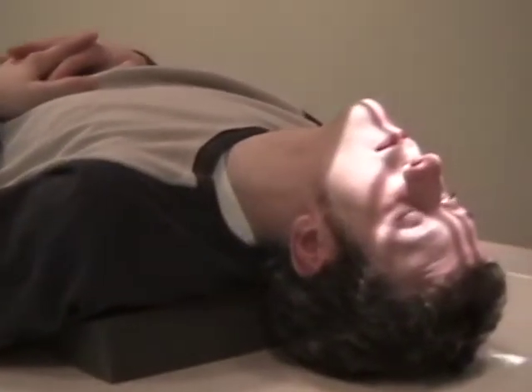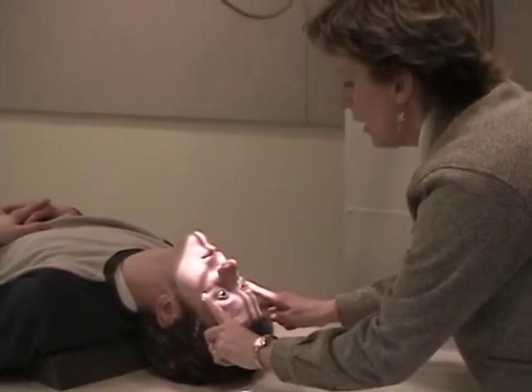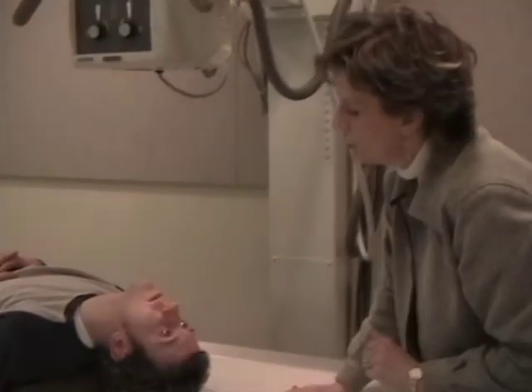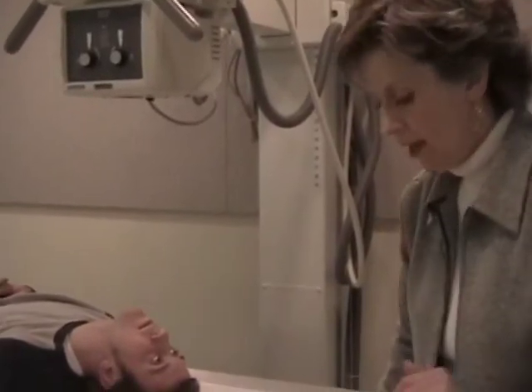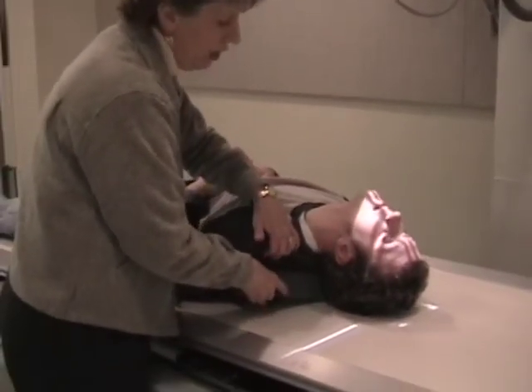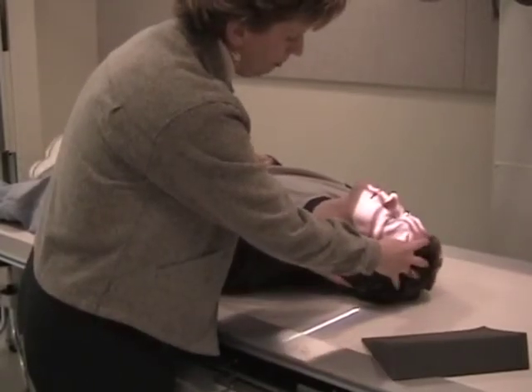And then you check for the MSP for centering purposes, and that there's no rotation. I'm looking at the outer canthus, lateral border of the skull, and that would be a reverse Waters or a reverse parietal acanthion. In a real trauma situation, it may not be likely that you're going to use a sponge and to have the patient extend that chin more. So we're just going to kind of mock it here a little bit.